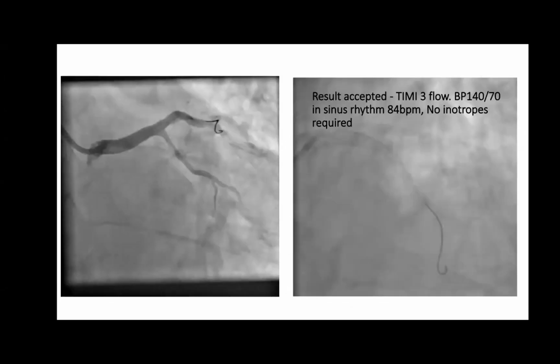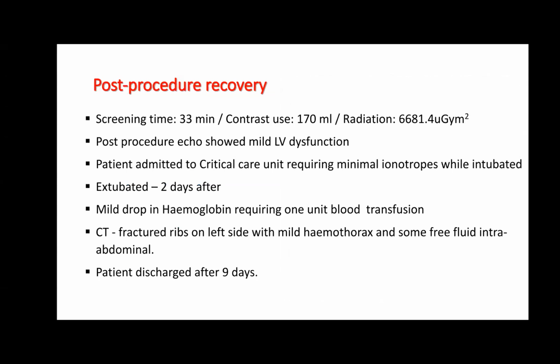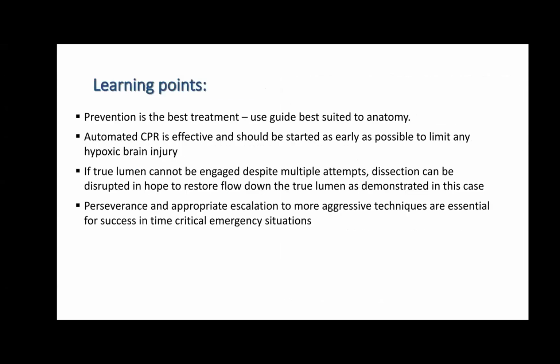Yeah. So the learning lessons are simple. I think prevention is the best treatment. When the guides are not sitting in, there is no point in maneuvering them in. We should change them. The other point, you could easily argue, is what one operator mentioned: you should always take a diagnostic catheter before the start of the angiogram, because that shows you the configuration, and you can then decide what sort of guide is going to best sit down.